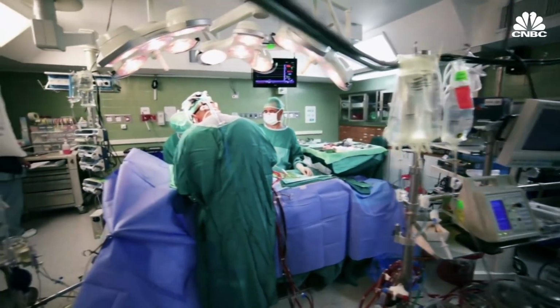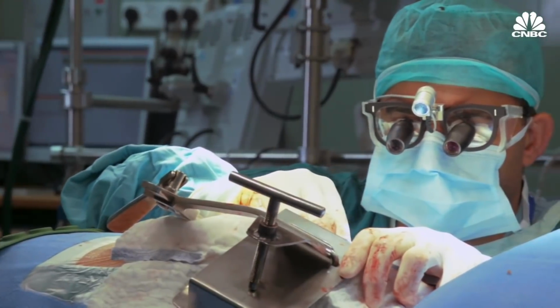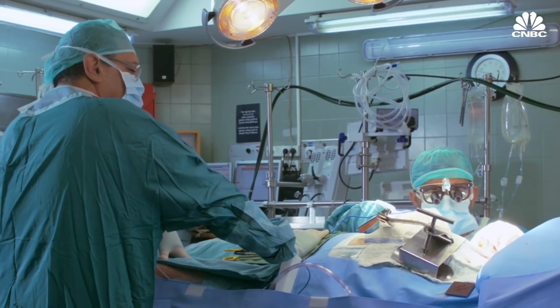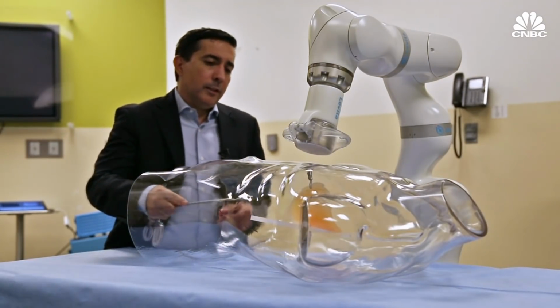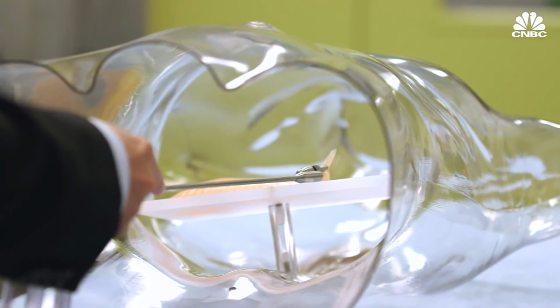If you've never had surgery before, it can be shocking to find out even simple procedures mean you'll have 4, 5, even 6 incisions made in your body. So we move the magnet out. Meet the surgeon who is using magnets to change that, Dr. Alberto Rodriguez Navarro. We are the first company in the world to develop magnetic surgery.